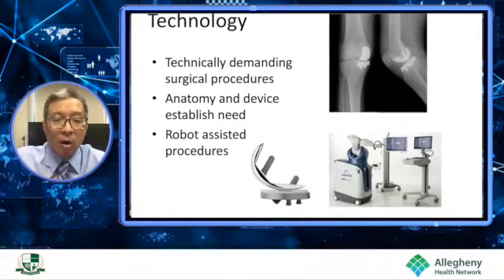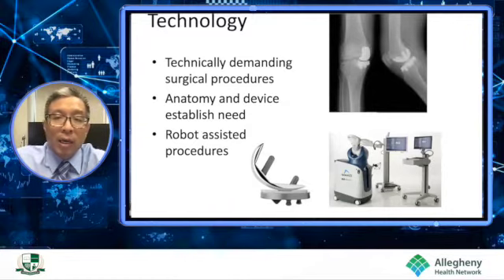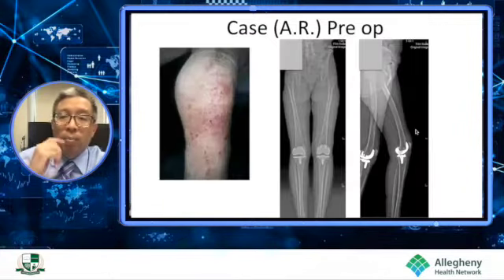The Mako technology really brought about a robot-assisted procedure for unicondylar knees that didn't have a lot of the pitfalls and the clumsiness associated with either freehand or a lot of the instrumentation designed to support unicondylar knees that were cumbersome. This is an example of the robot, and also the implant itself. And in the upper right hand, you see a patient implanted.